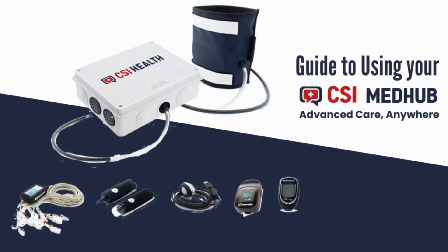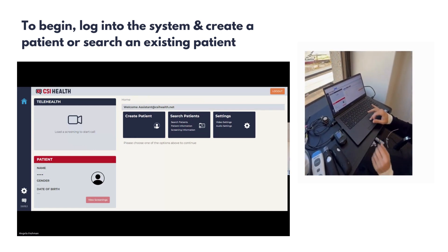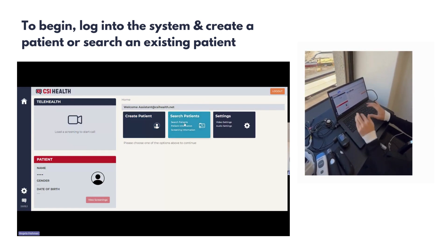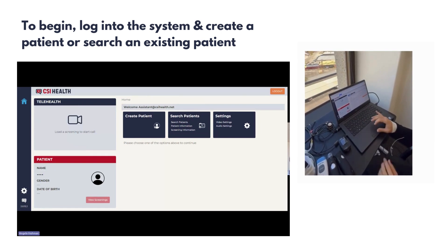Today we will take you through the CSI MedHub virtual screening process. To begin, you will log into the system and either create a patient or search for an existing patient. In this demonstration, we will create a new patient.